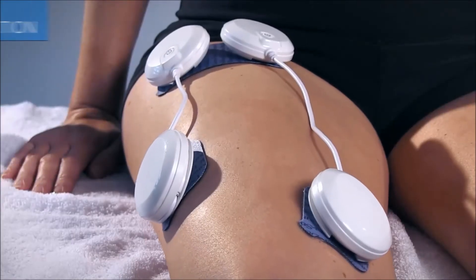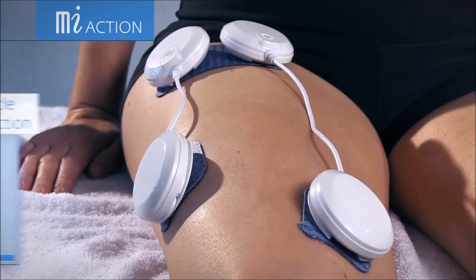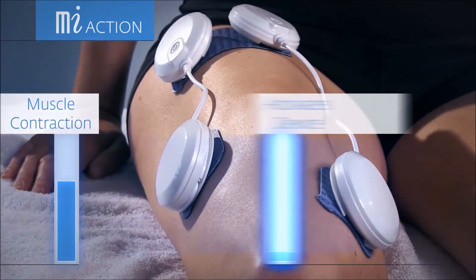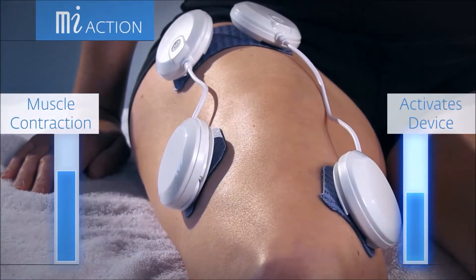MI Action allows patients to trigger the stimulation with their own active muscle contraction.